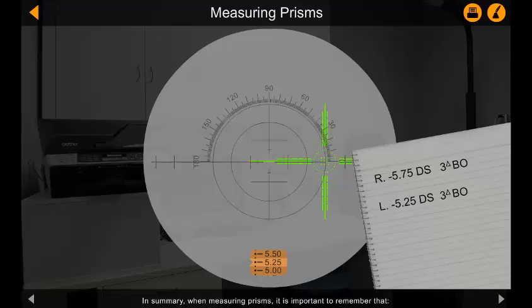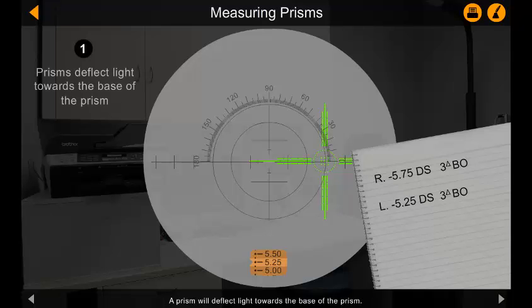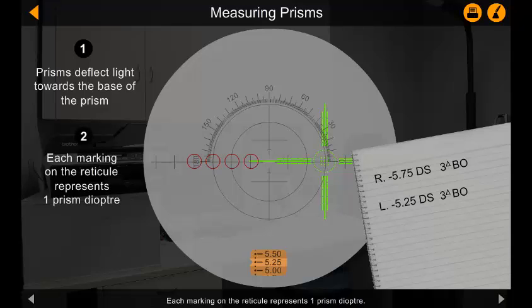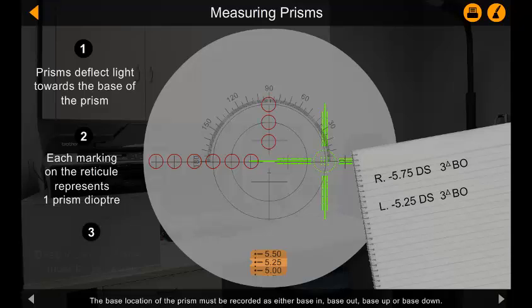In summary, when measuring prisms, it is important to remember that a prism will deflect light towards the base of the prism. Each marking on the reticule represents one prism diopter. The base location of the prism must be recorded as either base in, base out, base up or base down. The base in and base out positions are different for each eye lens.